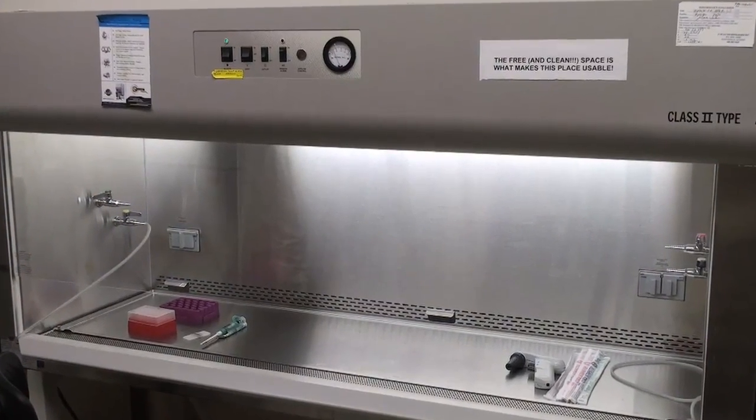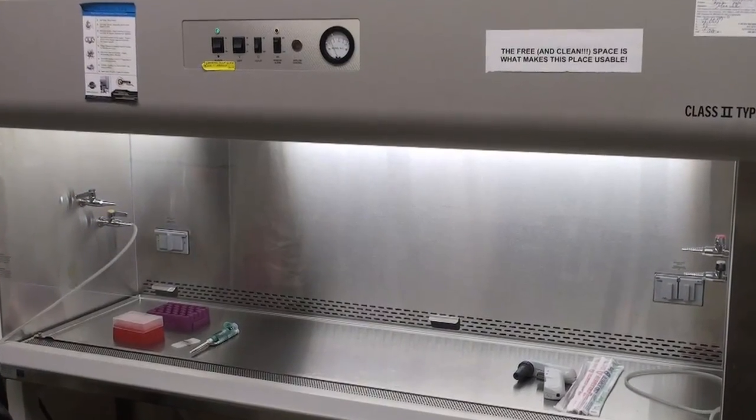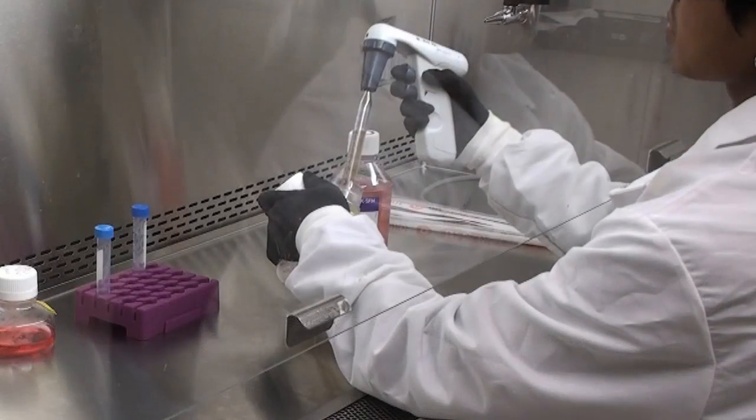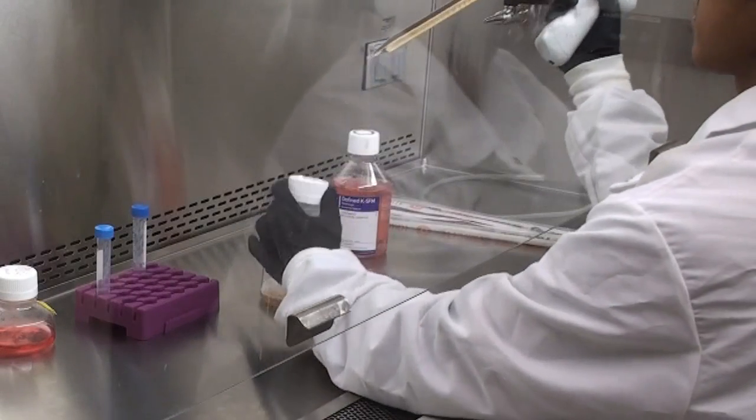Once the media is warm, dry and spray it with 70% ethanol. Make sure to spray the underside of the loosened cap. Place it inside the hood and add appropriate supplements to condition the media.